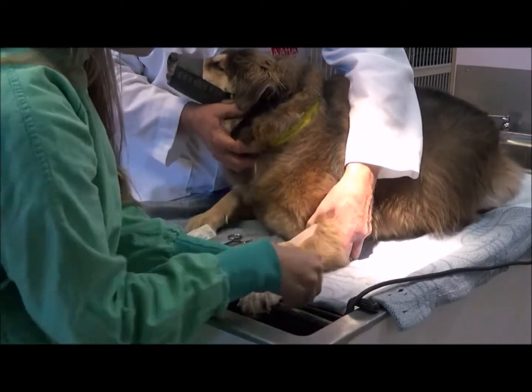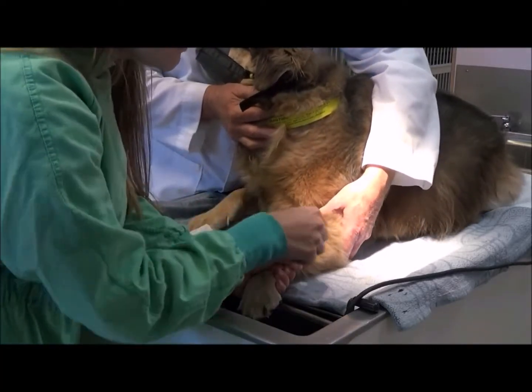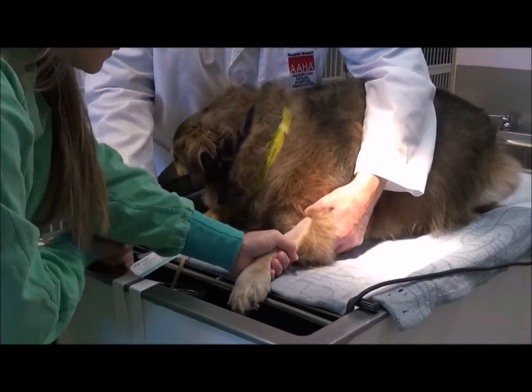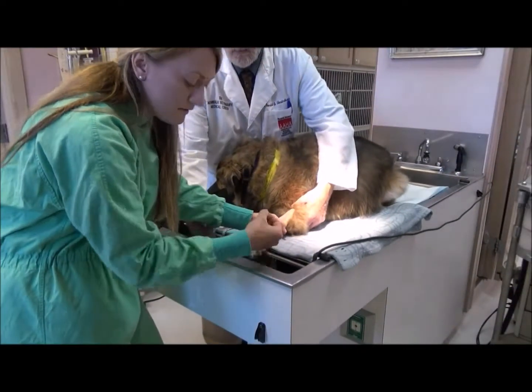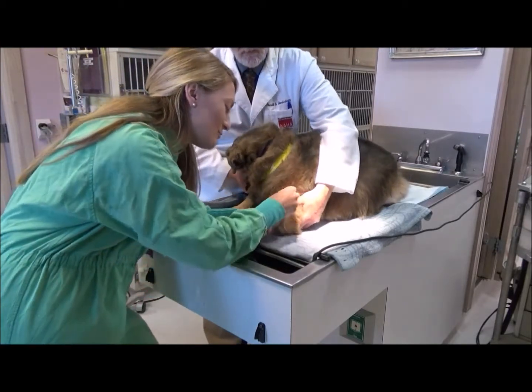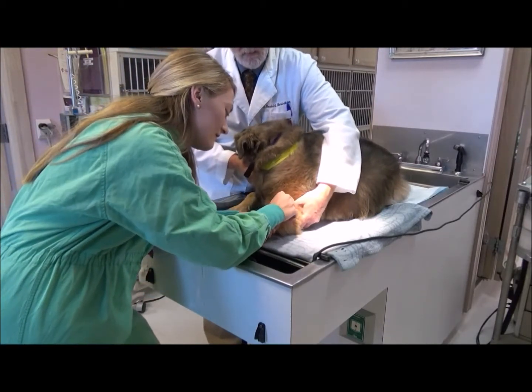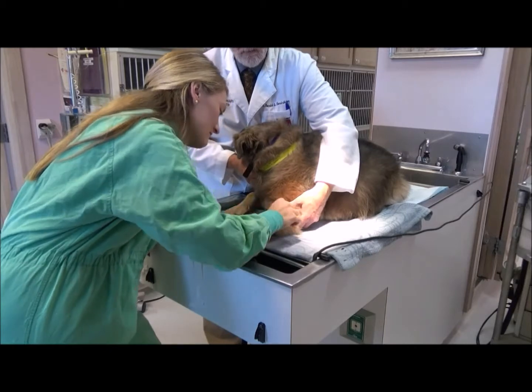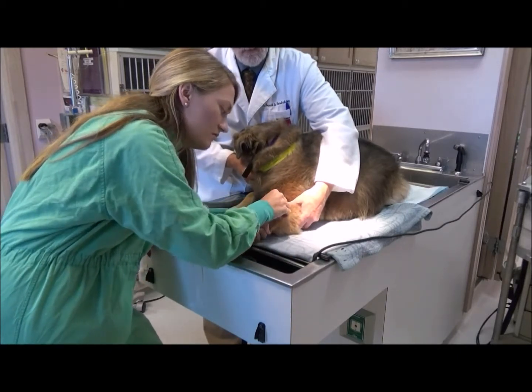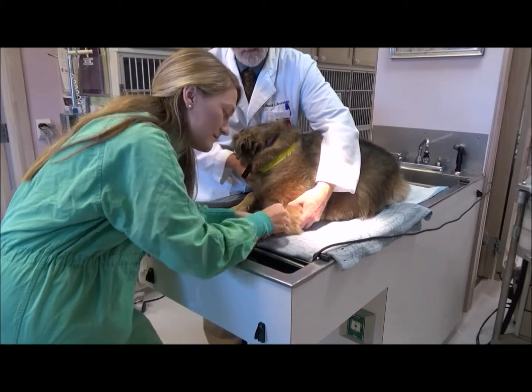Okay, I'm now going to scrub the leg using the target pattern method. I'll use a 2% chlorhexidine scrub soaked cotton ball, and then I'll follow it with 70% isopropyl alcohol. And you want to do this a minimum of 3 times.